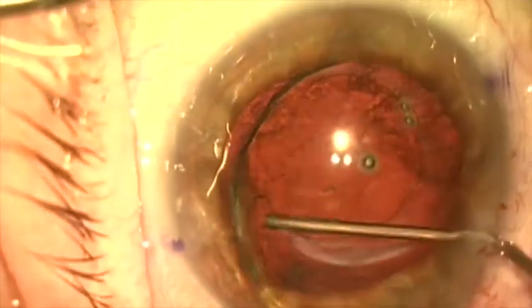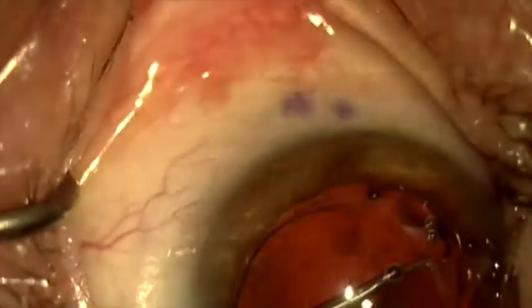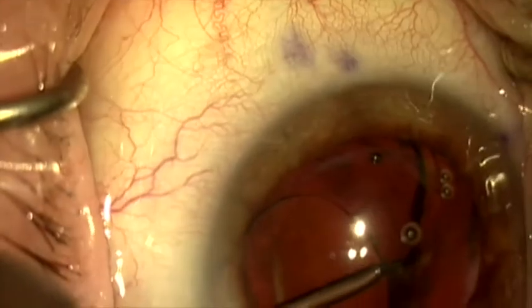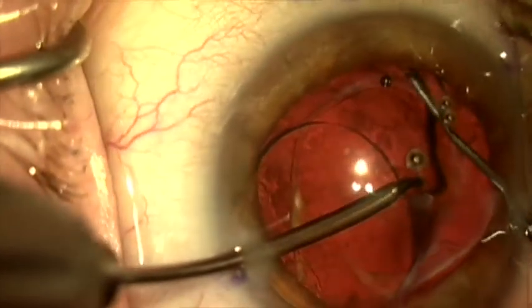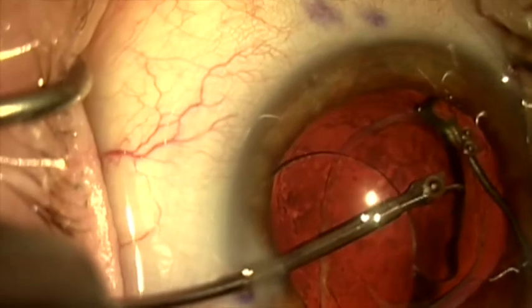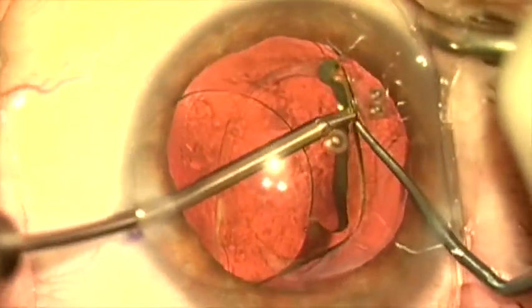We'll now manipulate the optic up out of the bag, injecting some viscoelastic to support the equator of the bag on the left side. I'm going to grab the other haptic with a micro grasper and use that to manipulate it while I strip the fibrosis off the other haptic using a Sinski hook. You can see here that there's a loop of fibrosis around the end of the haptic that we're going to very carefully manipulate off so we don't strip zonules. I'll re-grab the haptic and manipulate this loop of fibrosis off the end to free it up and bring it out of the bag.